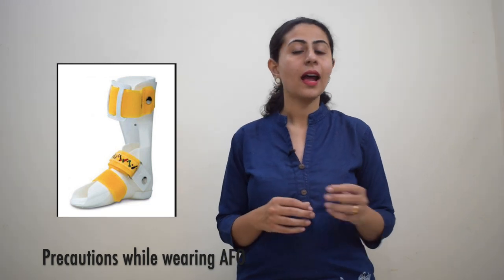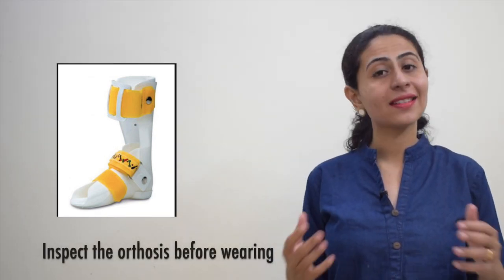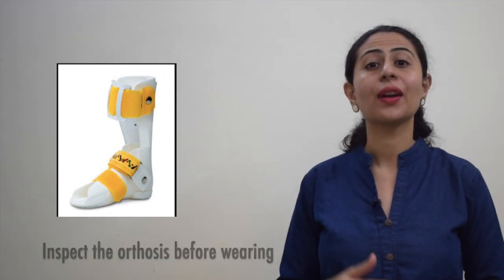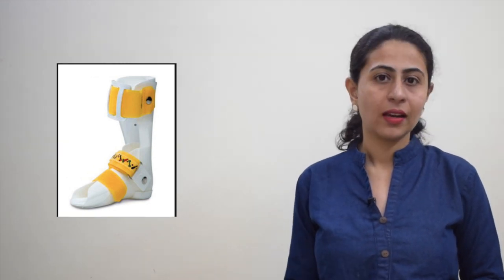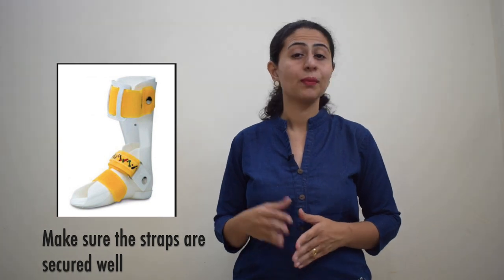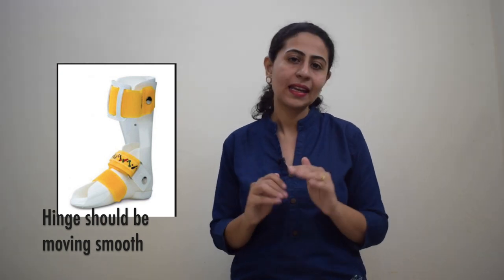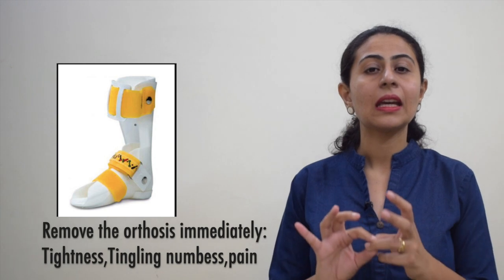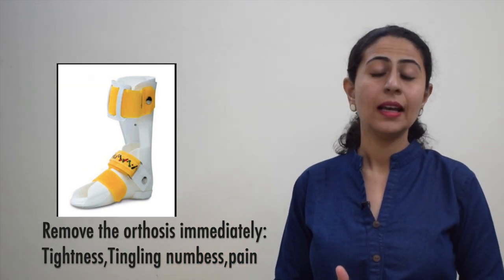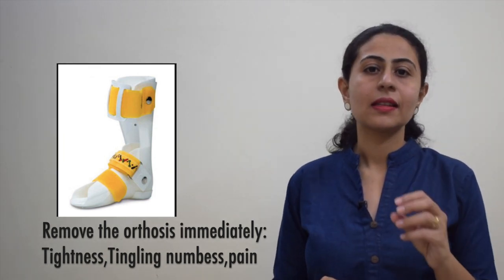There are some precautions to keep in mind while your child is wearing ankle foot orthosis. First, inspect your child and the ankle foot orthosis before wearing — look for stress, cracks, or any loosening of the joint, as this might damage the child's leg or skin. Make sure the straps are secured well before the child attempts to walk or do any activity. If the ankle foot orthosis has a hinge, make sure it moves smoothly and does not make any noise. Remove the ankle foot orthosis immediately if the child complains of tightness, tingling, numbness, or pain in the area where it is worn. This is a sign that the orthosis is too tight, not worn correctly, or there is damage to the product itself.